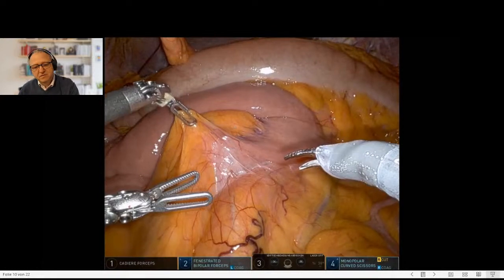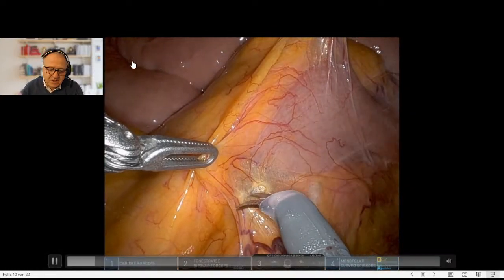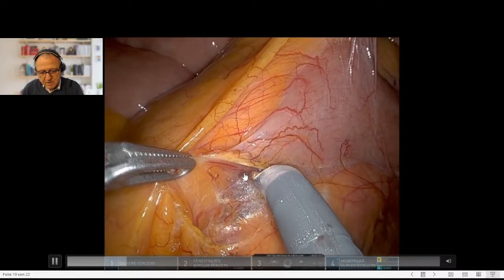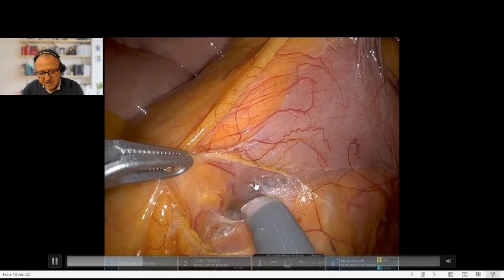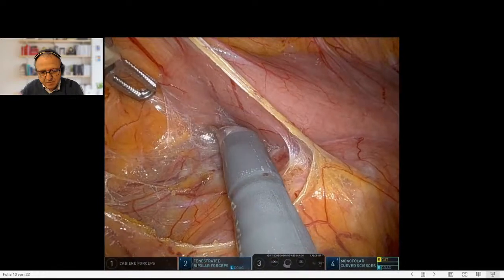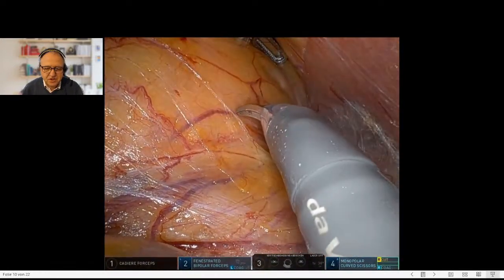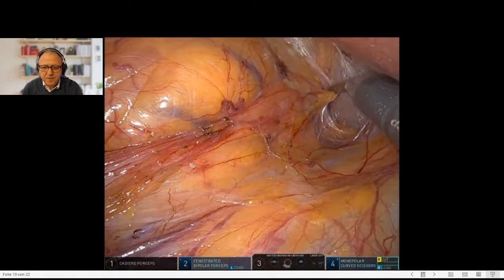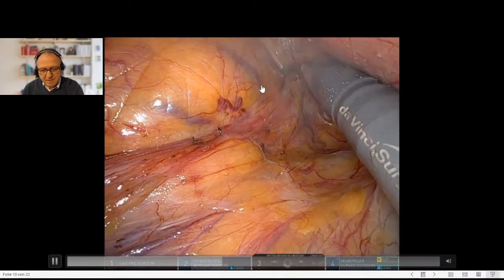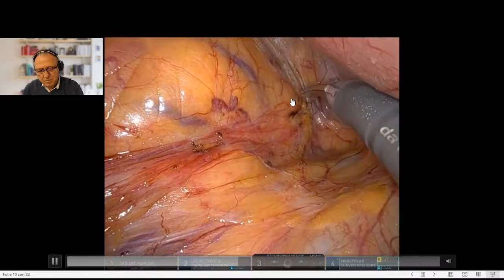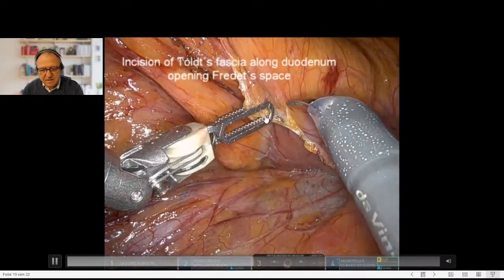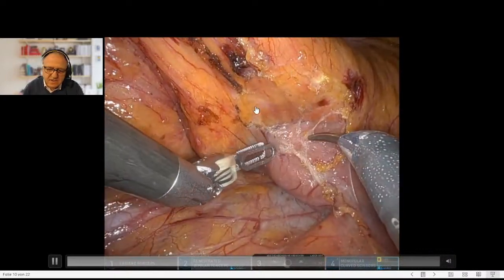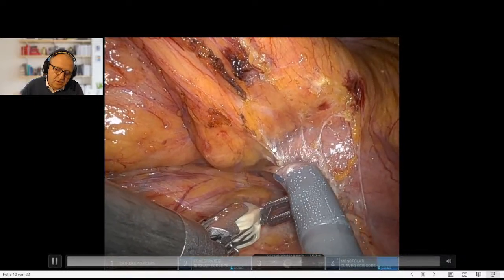Now this is the video of the first step. The small bowel is in the right upper quadrant and we incise the peritoneum just dorsal to the duodenum. Then we go right to the wall of the duodenum, which is then gradually followed in a medial to lateral fashion. This makes some sort of a Kocher maneuver. The anterior renal fascia is pushed down.